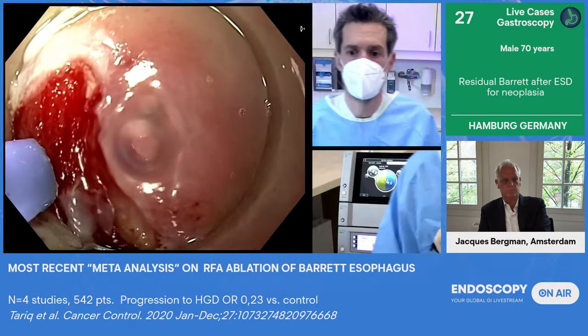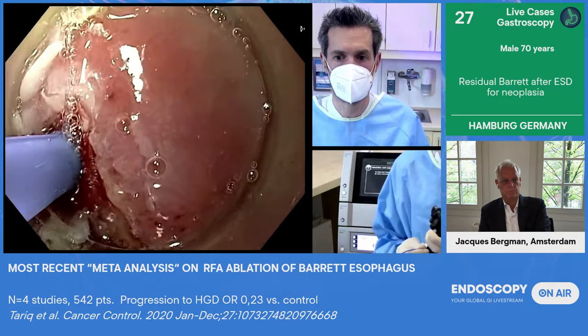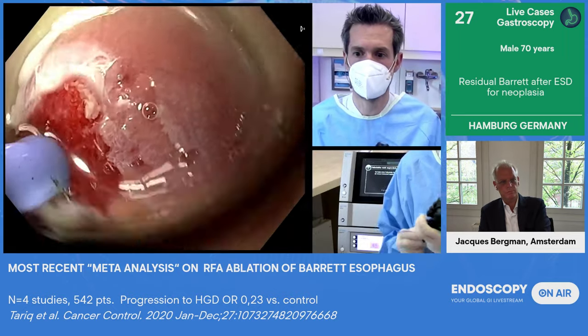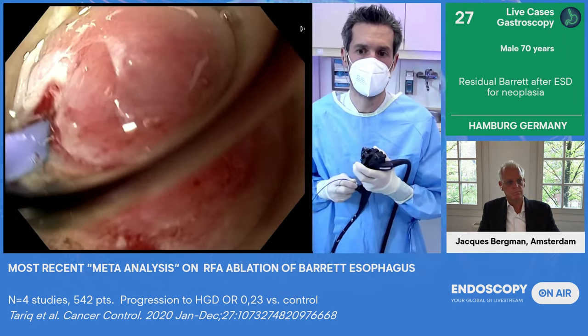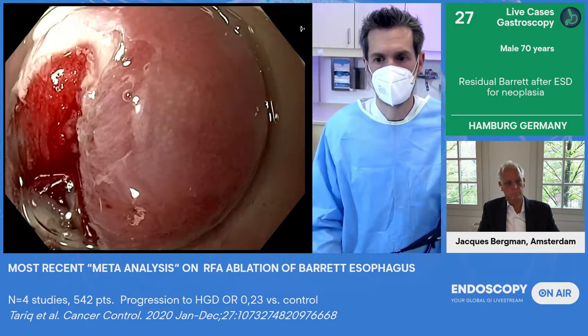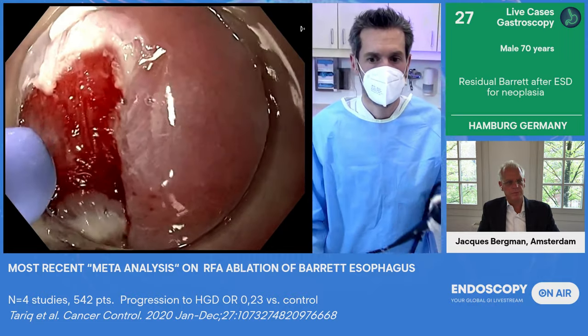And before that, we are doing another injection to lift up this area again and get the submucosal cushion, which provides some protection for the muscle layer so that the damage and the heat effect is not going too deep. Now you've seen the lifting sign a little better, still quite close to the mucosa, so it's hard to see. And now we're doing the second round.